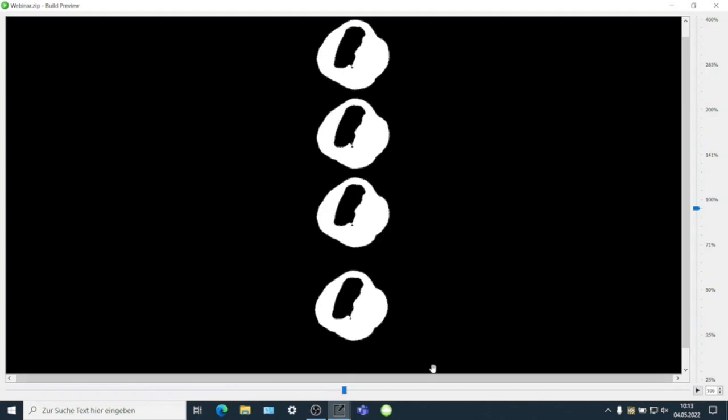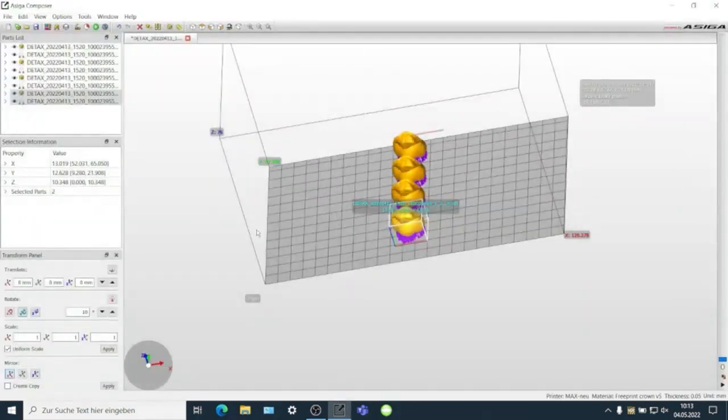All looks fine. So that means we can close this window and we can go to the printer, to the praxis part now, how to print a permanent crown like a pro. So let's go together to the printer.